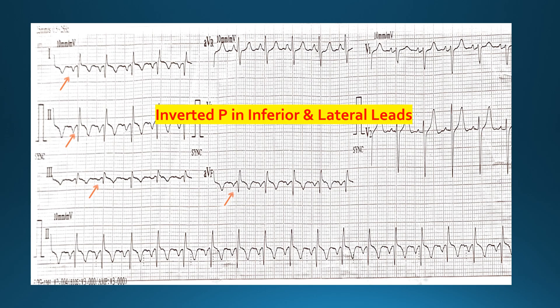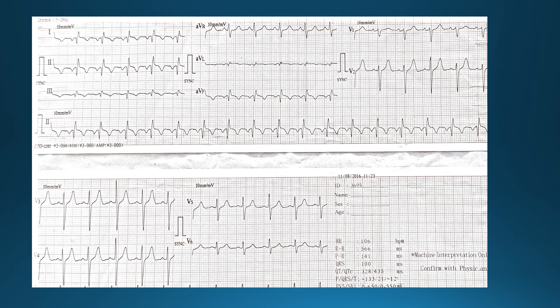Before reaching a conclusion for all these findings, let us look at the chest leads as well. Looking at the chest leads, we can see that there is a good, healthy progression of the R waves and there are no abnormal findings of any note. This means that the majority of the findings lie over the limb leads.